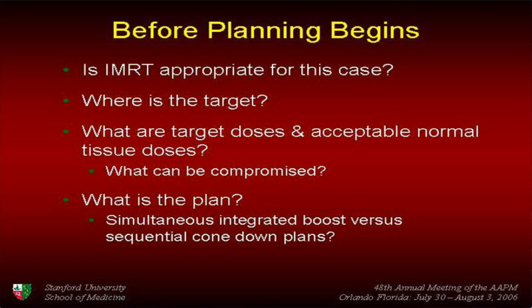And before the planning begins, it's helpful to ask, is this case appropriate for IMRT? Again, we talked about what cases are useful, but you also always want to discuss, is this a good patient to lie still for 30 minutes or 40 minutes on the treatment table?